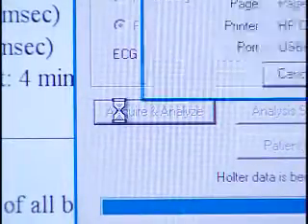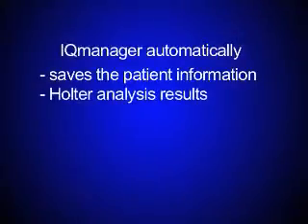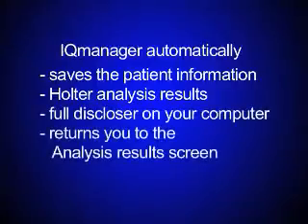You have now completed the Holter download for your patient. IQ Manager automatically saves the patient information, the Holter analysis results, and the full disclosure on your computer and returns you to the analysis results screen.